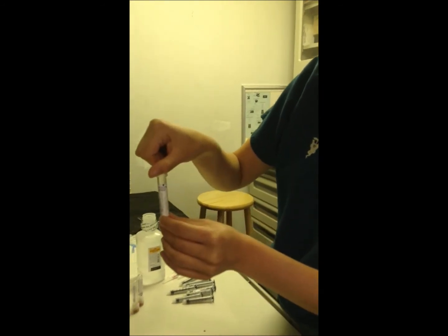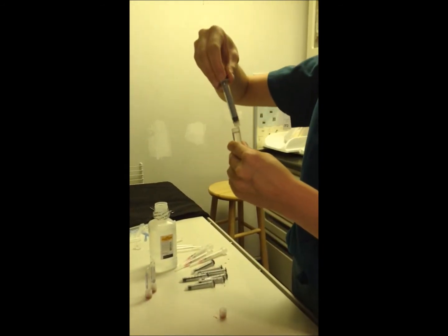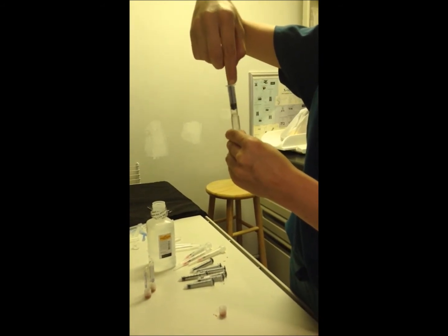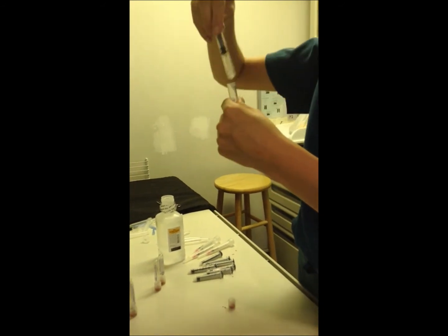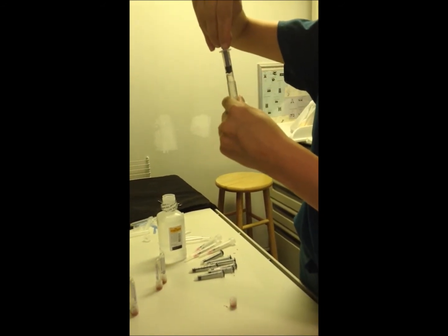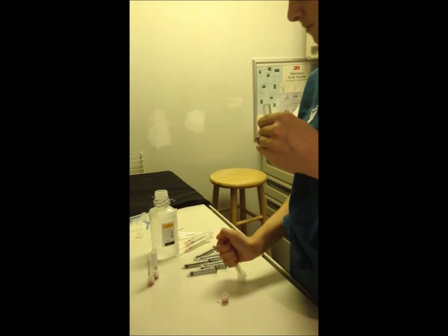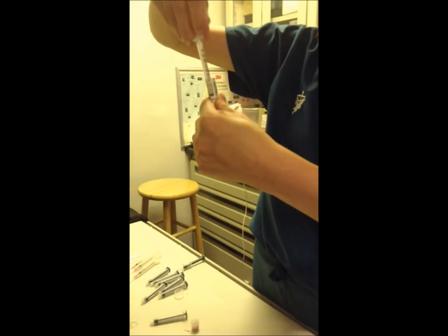The second wash, we're going to remove the supernatant. This is Ruby's erythrocyte wash. So you're going to remove all of this. Syringe is too thick.